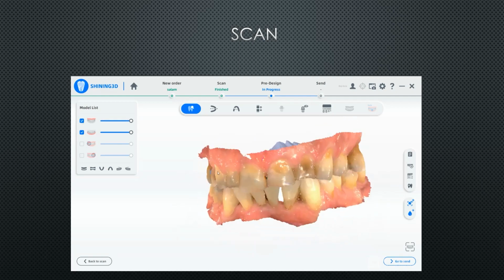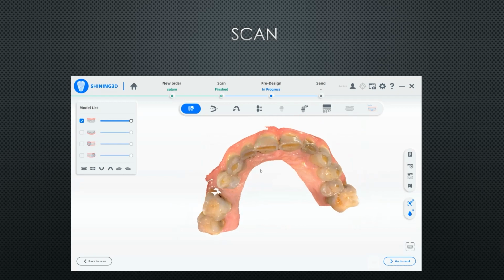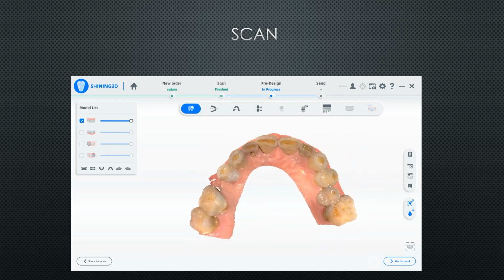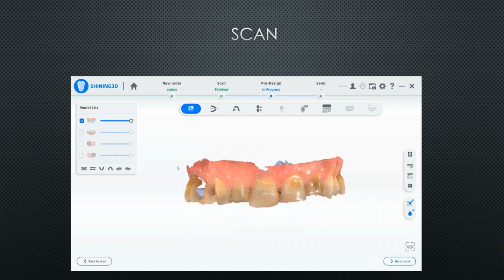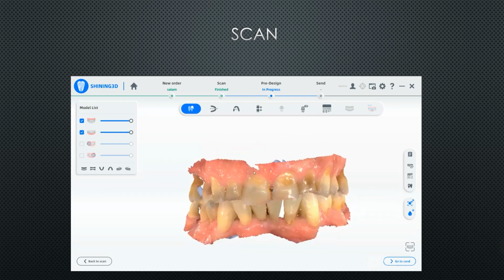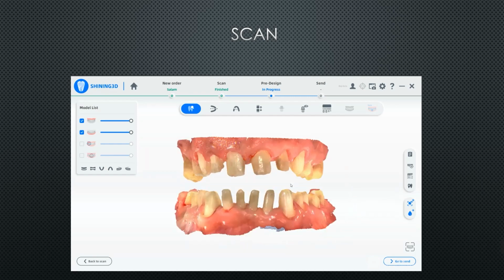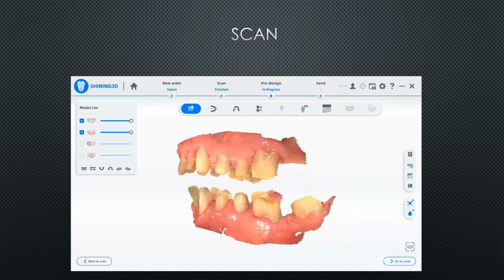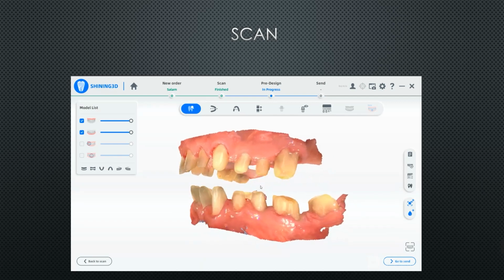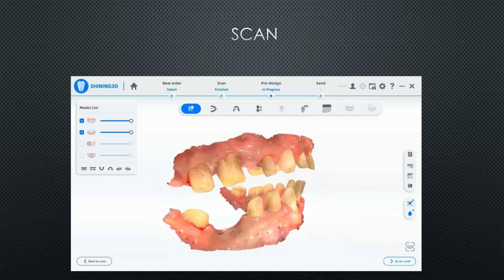I made some temporary teeth and put it inside the patient mouth. We look here, we see the attrition apparent. If you go slightly more with the video. Okay, so this is his scan. If you look at his scan, we take the scan on this vertical dimension. This is the core of this lecture, how to take a scan with this vertical dimension, the new vertical dimension.